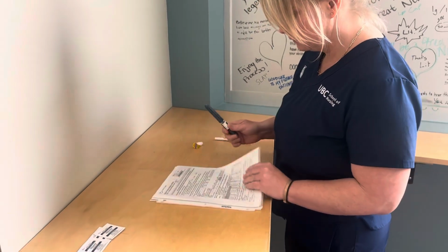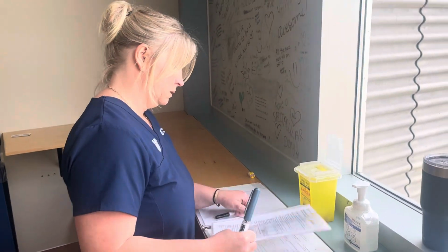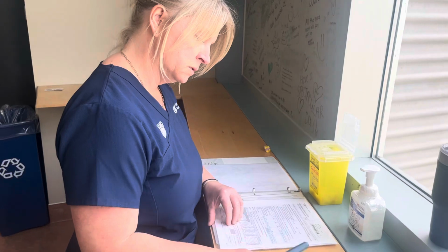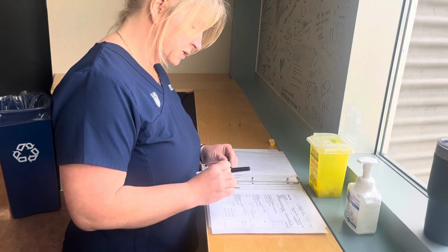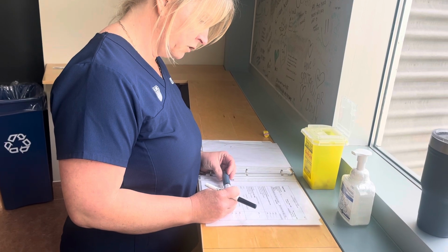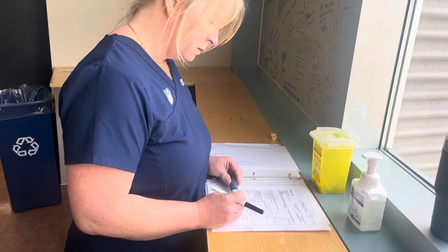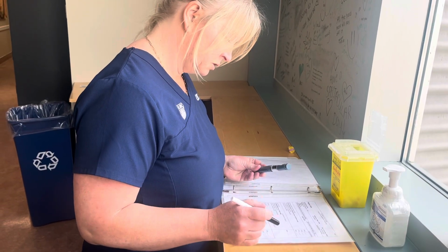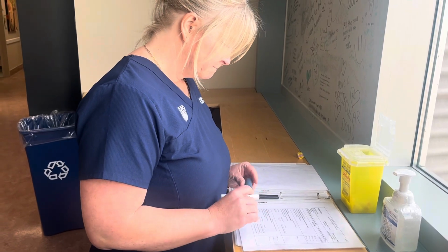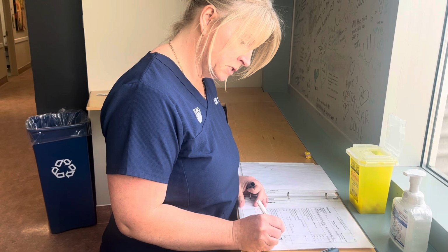Okay, so I'll take that from the Omnicell. I'll go back over to the MAR here. I'm going to check my 5 rights again in front of the MAR. I've got right patient, Polly. I've got the right drug, aspart at 100 units per mil. The right route, sub-Q, the right time, 12:30. Okay, and my double checks. So I'm happy with that. I'm going to dot the MAR.